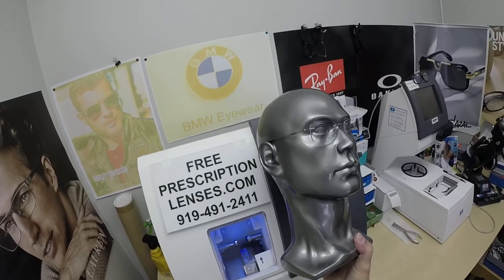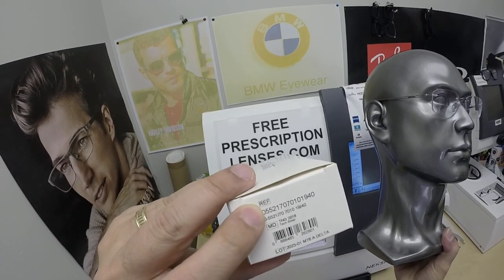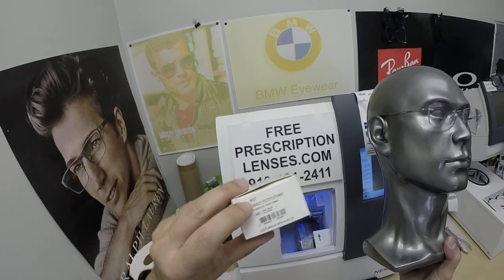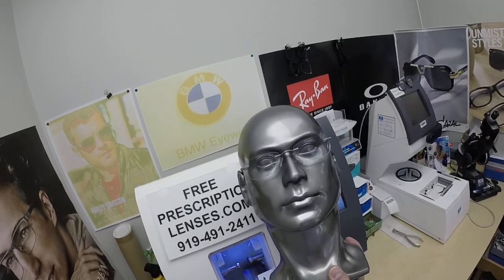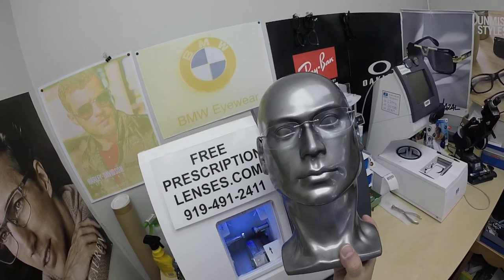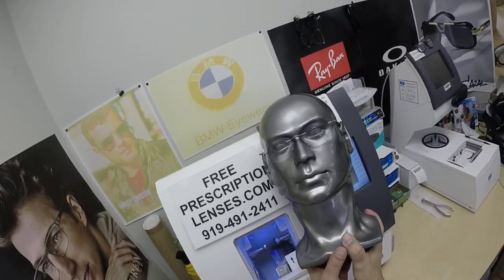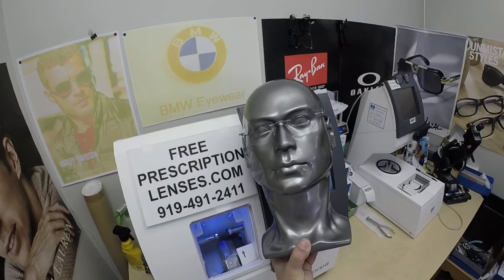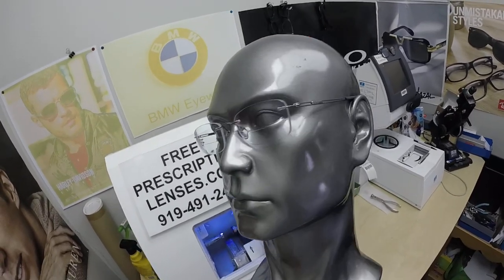Burt in Tacoma, Washington — thank you so much for the purchase of the Silhouette 5521 with the traditional titanium hinge, color 7010, silver, with shape EW in the 52 eye size. And now everyone else has gotten a chance to see how I bring that loving feeling back to glasses. Thank you.